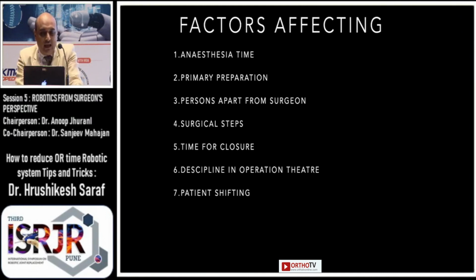So considering the anesthesia time, if we have separate induction room and anesthetic assistant, definitely we can reduce the time of the anesthesia. And if we allocate a separate person for the preparation of tourniquet, side post for the leg support, and who will enter and register all the patient details in the system.